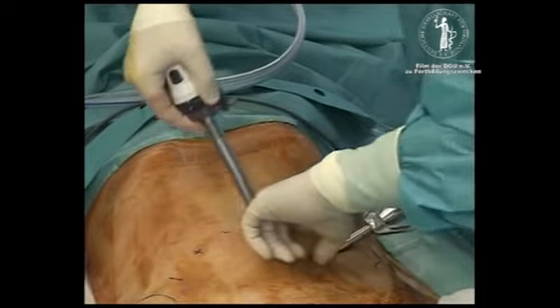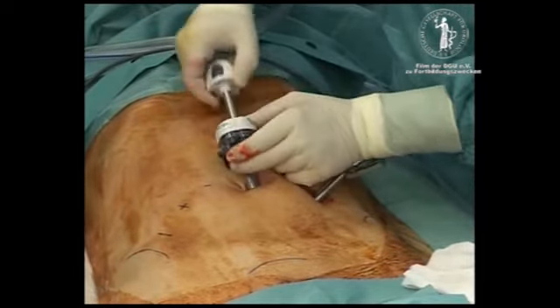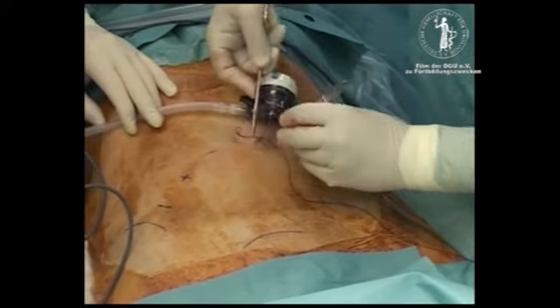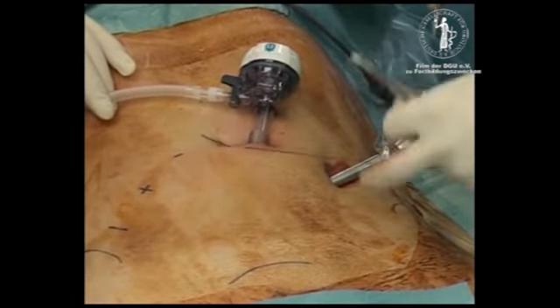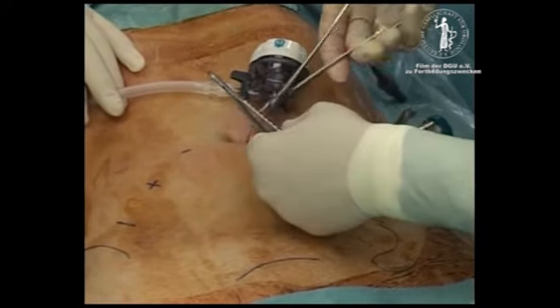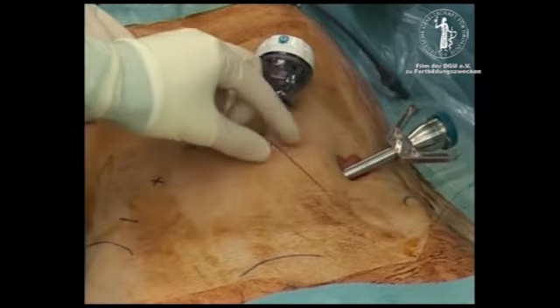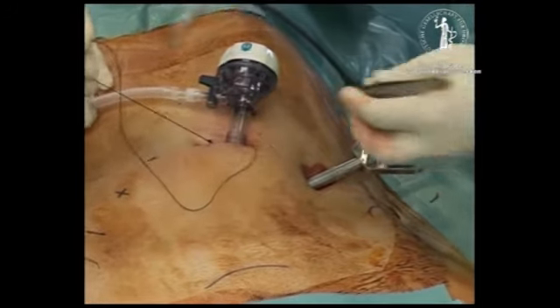Then the 12 mm camera trocar is introduced and the insufflation is started with high flow and a maximal intra-abdominal pressure of 12 mm of mercury. The camera incision is closed with a silk suture to reduce gas loss and maintain the intra-abdominal pressure. This incision is necessary at the end of the operation for the removal of the prostate in the specimen bag.